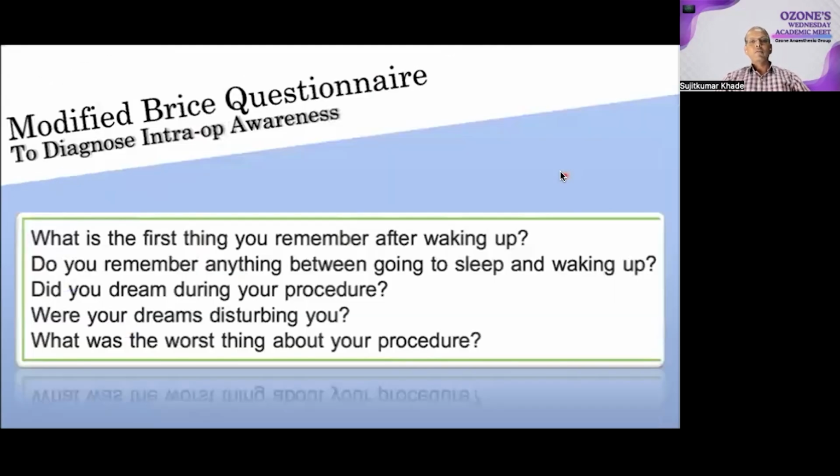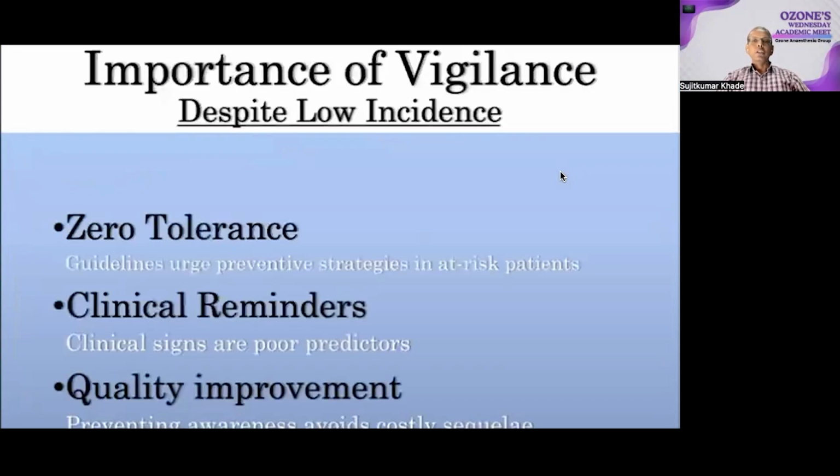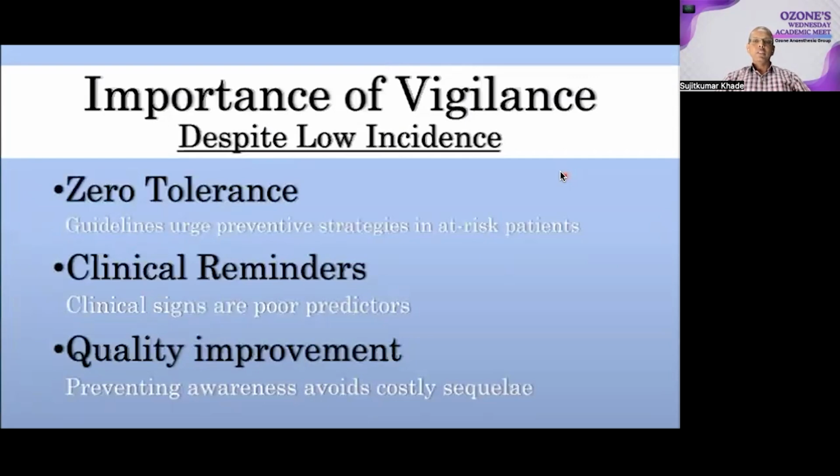When there is a concern for possible intraoperative awareness, the modified Brice questionnaire shown in this slide is useful in characterizing the event and has been shown to be more sensitive in detecting intraoperative awareness with recall compared with other methods. Even though rare, awareness is a never event given its devastating impact. Zero tolerance. ASA advisory guidelines urge preventive strategies in at-risk patients.